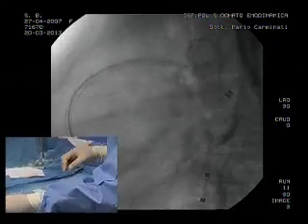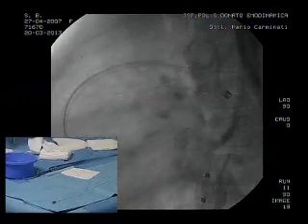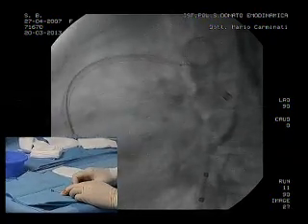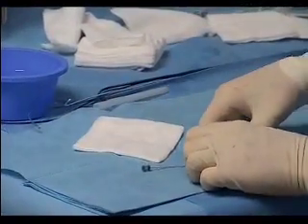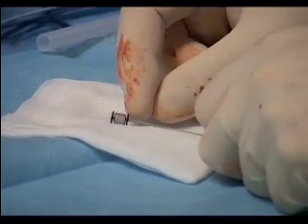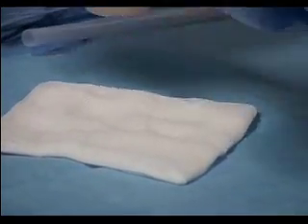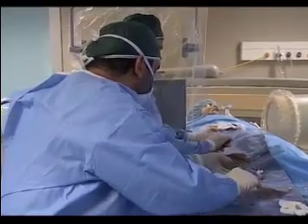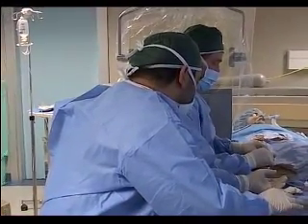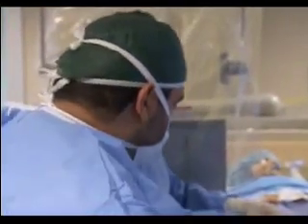Hmm. Well, can you see the table now? So this, can you see, can you zoom here? This is 5 millimeters and 6 millimeters length. Let's see whether. So Mario, this is very similar to the AVP2. Yes. With the difference that this only goes to 5 millimeters, and the AVP2 you could easily put a 6, 7, 8 millimeter that will adapt and wedge well into the ductus. That's why we were suggesting that an AVP2 may be a better choice with a slightly larger. You're limited here with a 5 millimeter diameter. Yeah, you may be right.